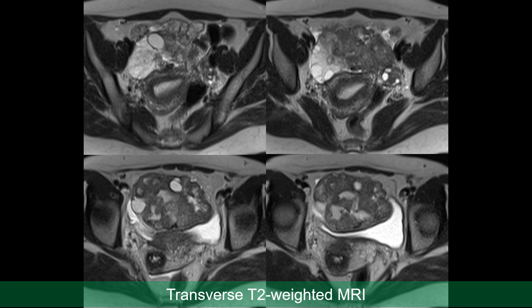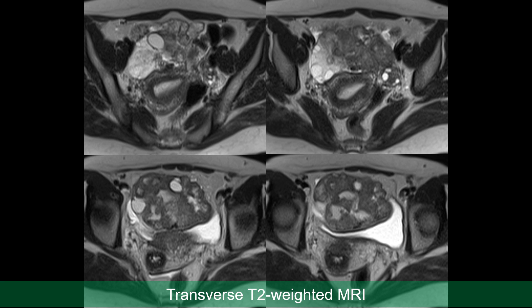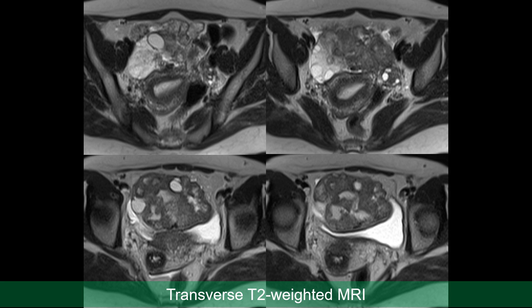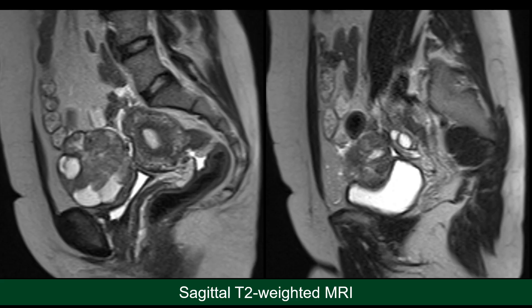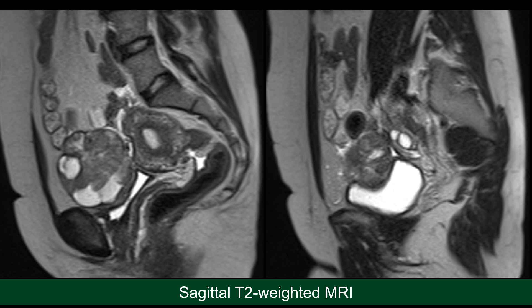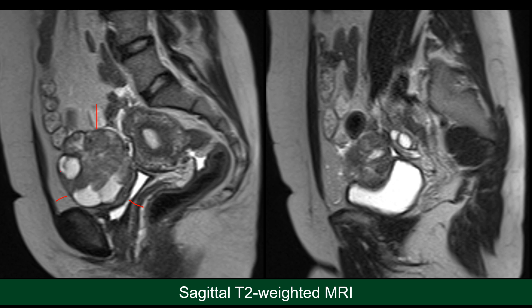For one reason or another, the surgical intervention was postponed and MRI was performed four days later. The T2-weighted images show the torsed right ovary in front of the uterus, starting to be devitalized along one side. This is the location of the torsed right ovary in front of the uterus — a typical location for ovarian torsion.